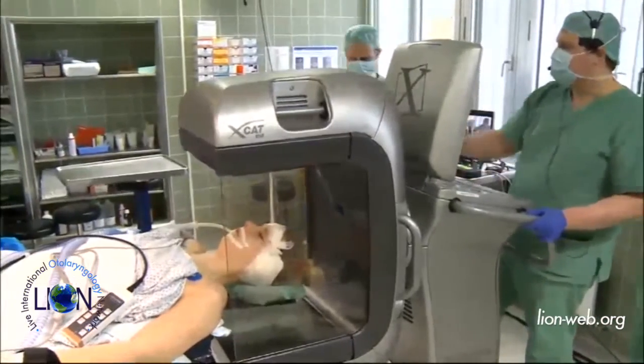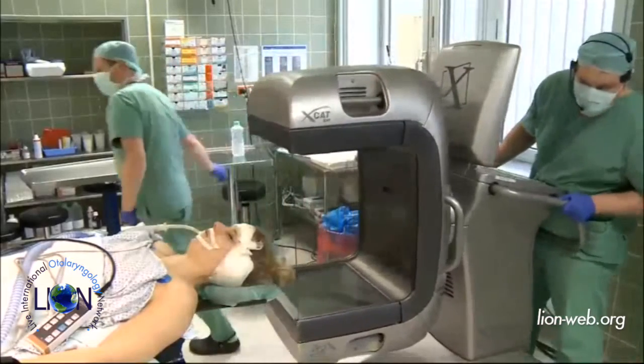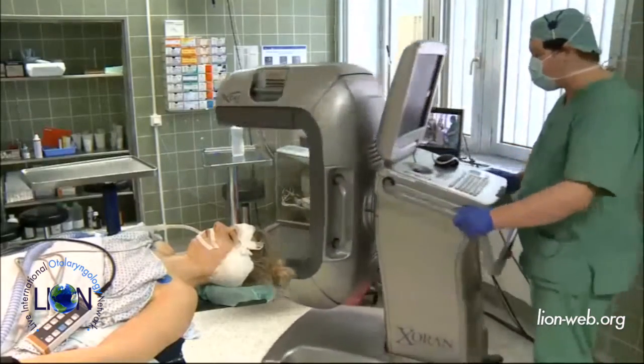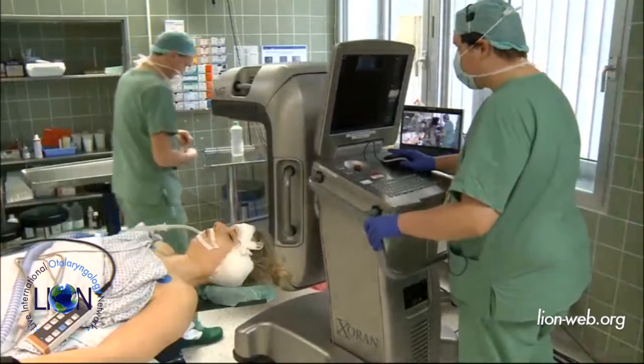We will now move the system so you can look onto the screen. Now comes the post-processing time, which takes some minutes.